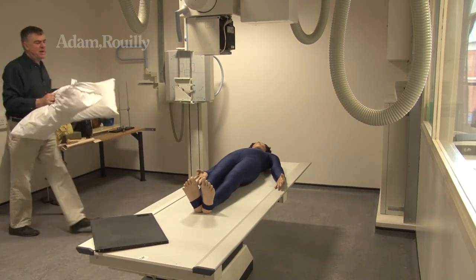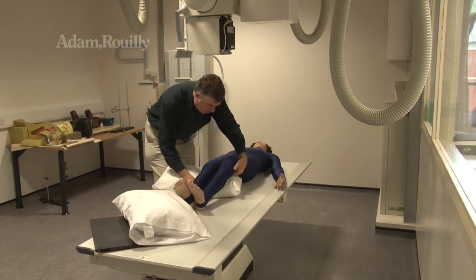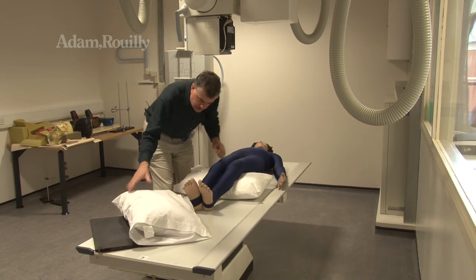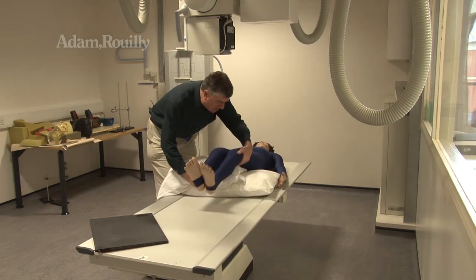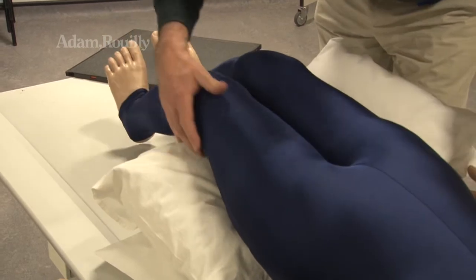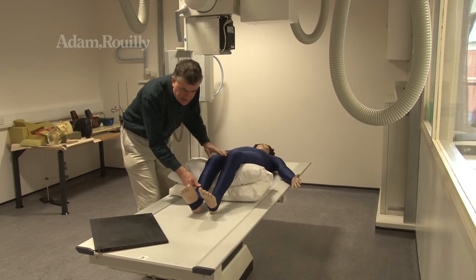So, two pillows to go under the knees. This is what we have to use in radiography, positioning aids to help maintain a position. Even real patients can't necessarily hold that position. I know this doll can't because it's an inanimate object, but the principles, as I say, are exactly the same as we do with real people, where necessary.